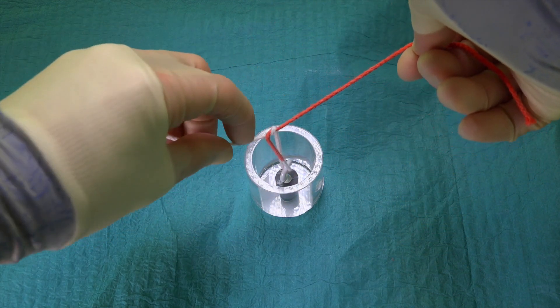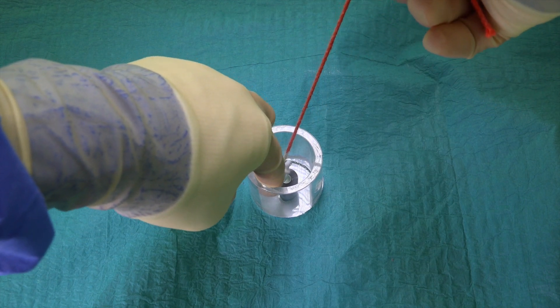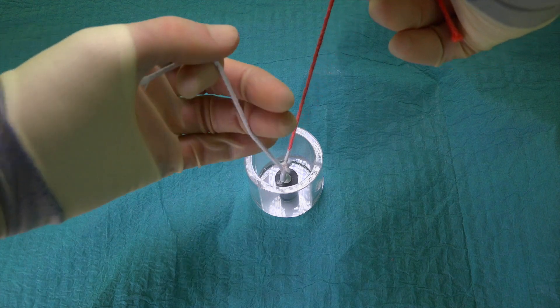As with any reef knot, it's important that we cross our hands with each throw. If we don't, then we will create a slip knot or a granny's knot, which is less secure than our reef knot.